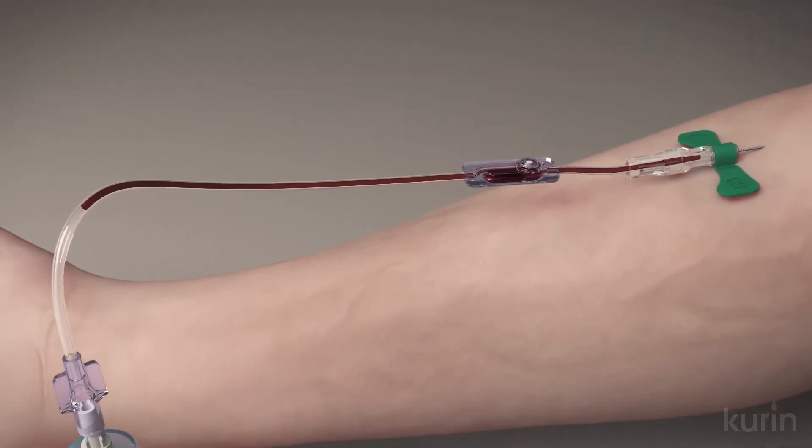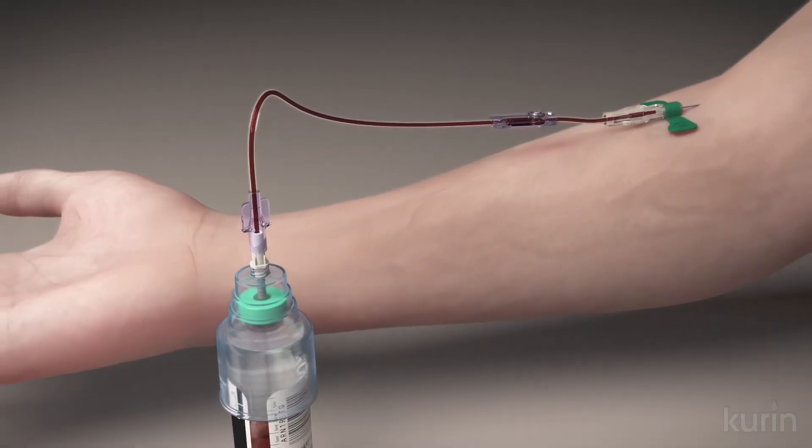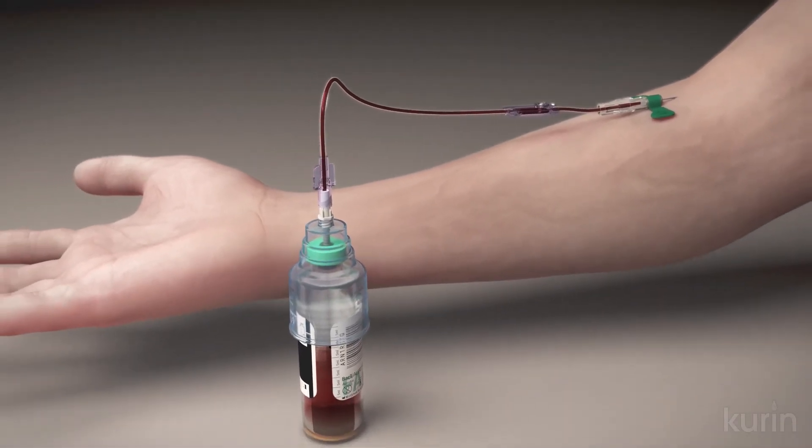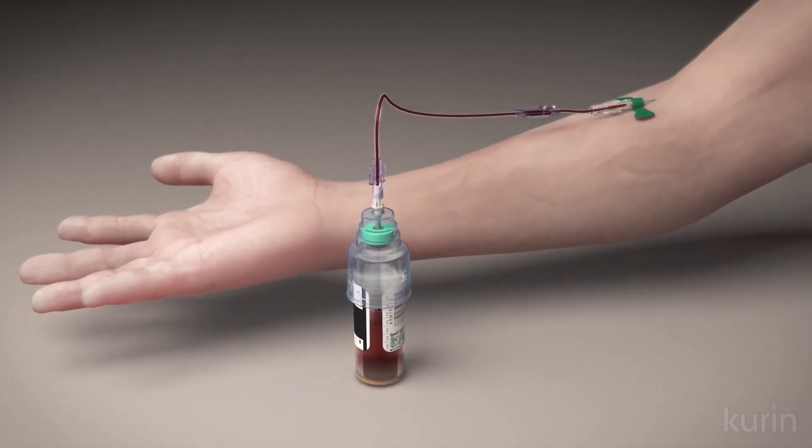Studies show that best practice compliance, combined with flash technology to sideline the initial flash of blood, can reduce contaminated cultures by more than 80%, improving the clinical value of blood culture testing for safer, more effective, and lower cost treatment of patients.